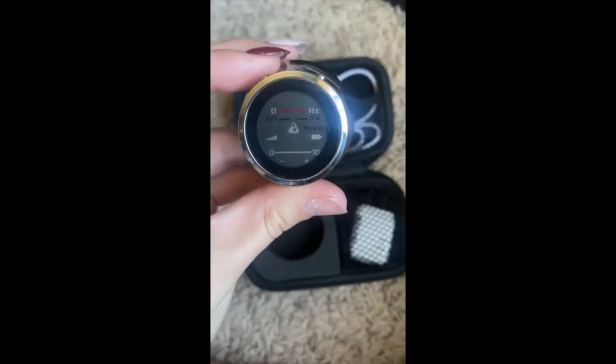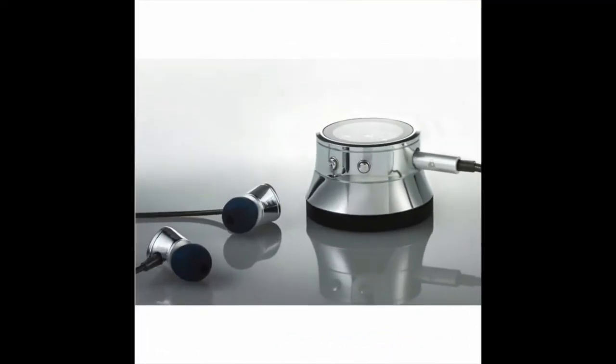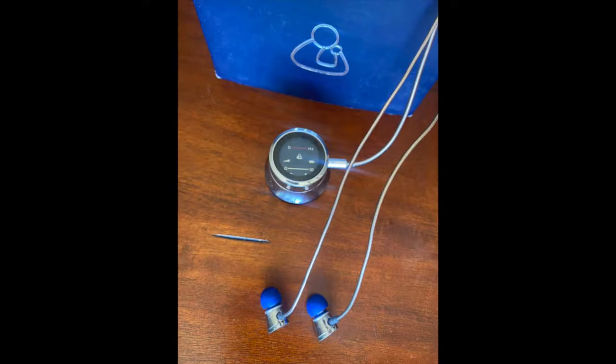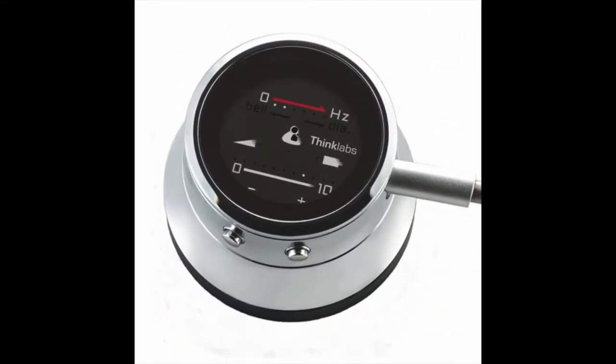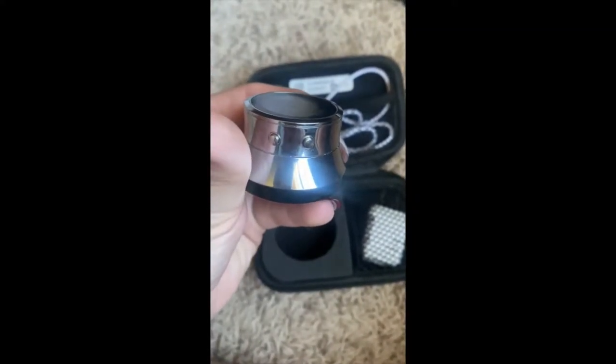The ThinkLabs Digital Stethoscope allows for doctors, nurses, or other caregivers who may be hard of hearing to raise the volume of the stethoscope in order to ensure the best care for their patients or loved ones. It also allows people to hear it clearly through the clothes of the patient or in a loud, busy environment such as an emergency room.